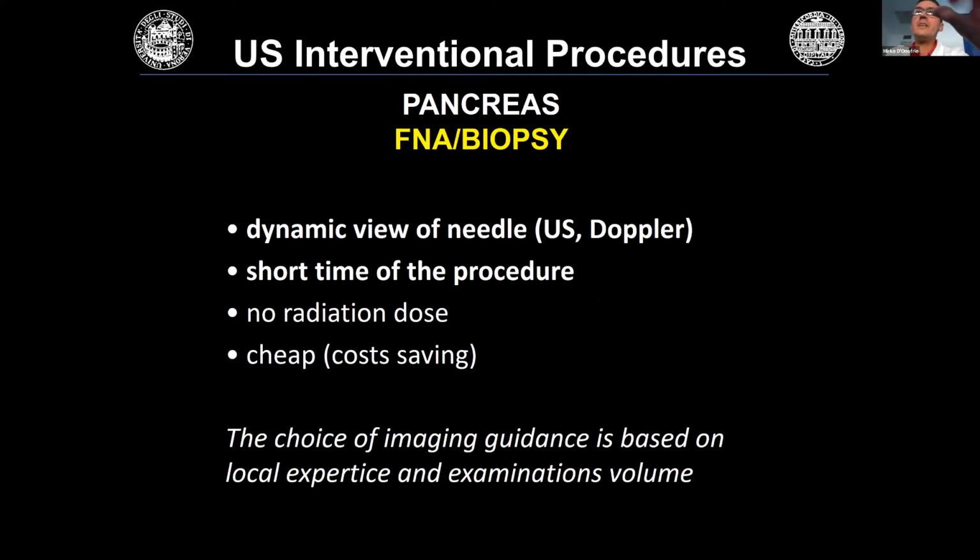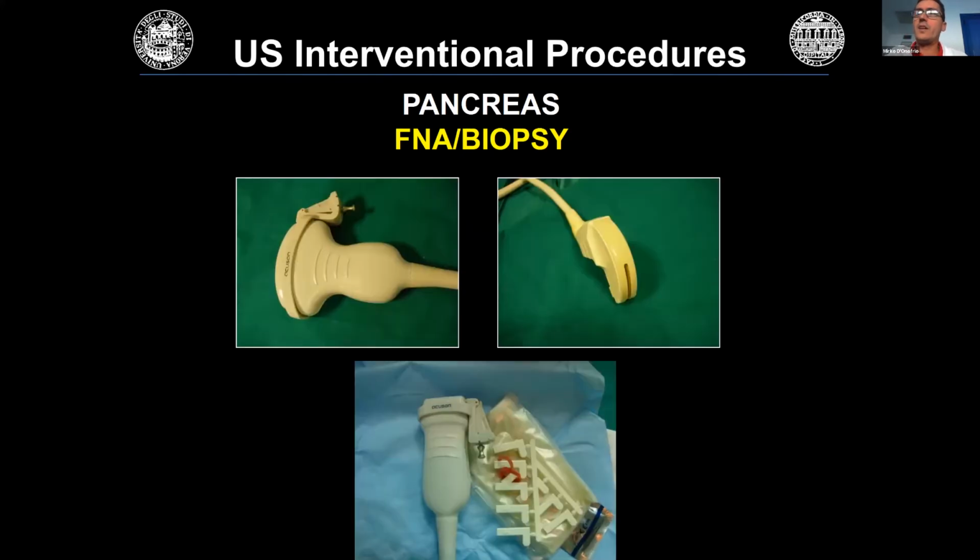A short procedure time means that in one breath hold, we can go inside the lesion and then go out. This is very important for difficult to reach lesions, and we are using a technique that is for sure cheap with respect to CT. However, the choice of image guidance is based on local expertise in every single center.